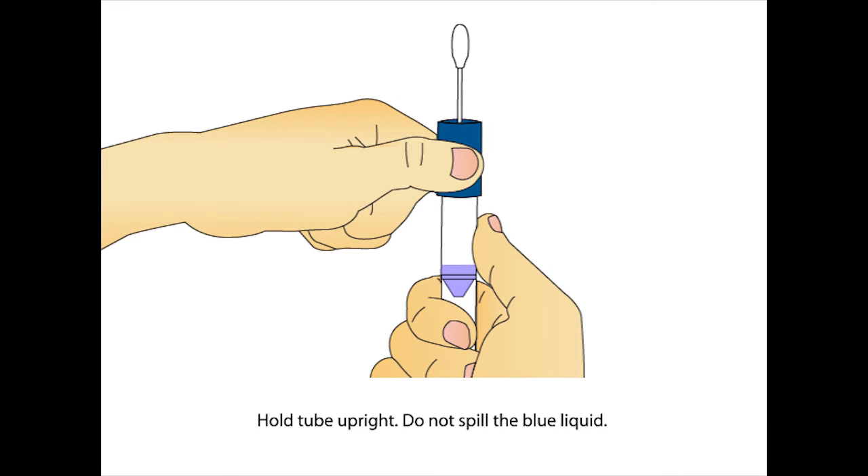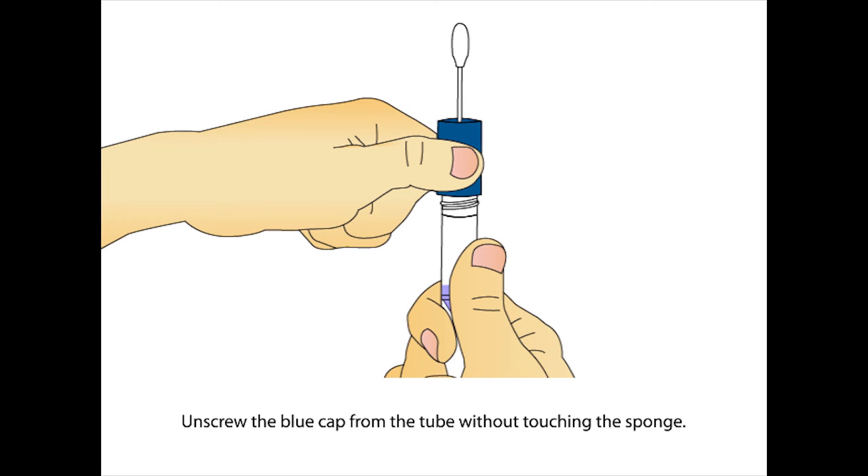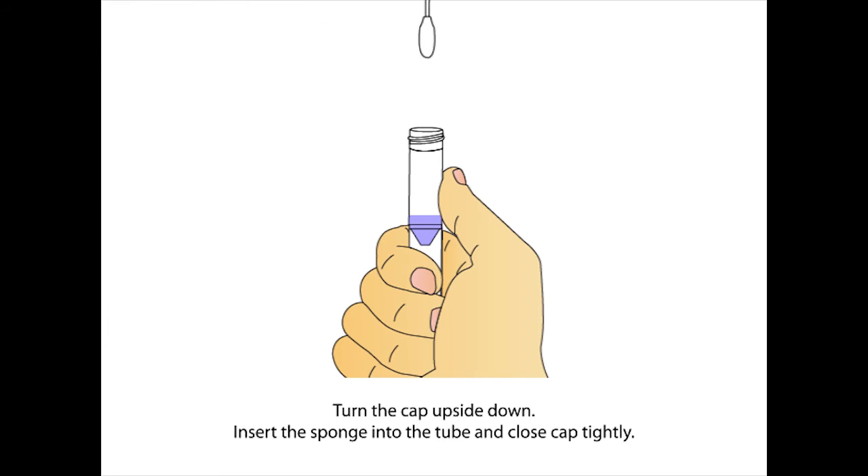Hold the tube upright to prevent the blue liquid inside the tube from spilling. Unscrew the blue cap from the tube without touching the sponge. Turn the cap upside down.